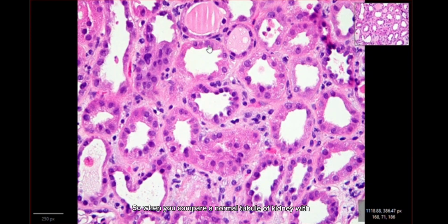When you compare a normal tubule of the kidney with the tubule having this infarcted area, you can see that the normal one has cells with a sort of normal architecture, with cytoplasm and intact nucleus, but when you observe here, you will see fading of the nuclei.